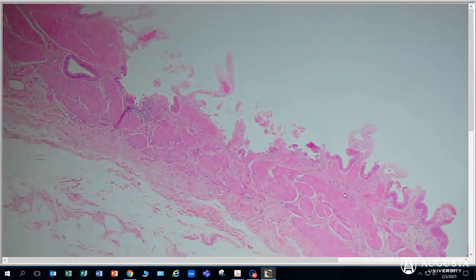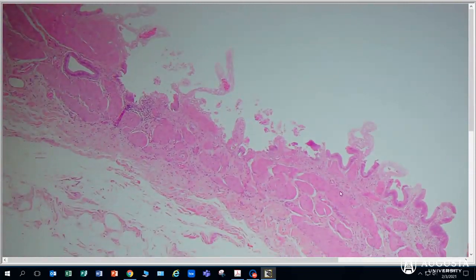So what we're looking for is the apical surface. So here we have lots and lots of tissue. All of the epithelial tissues are going to form the boundaries between our body and a cavity of some type. So this is going to form a boundary between our digestive cavity and the lining of our small intestine. The foodstuffs would be up here on the apical side. And down here we see big bands of muscle tissue and connective tissue, and even maybe some fat down here.